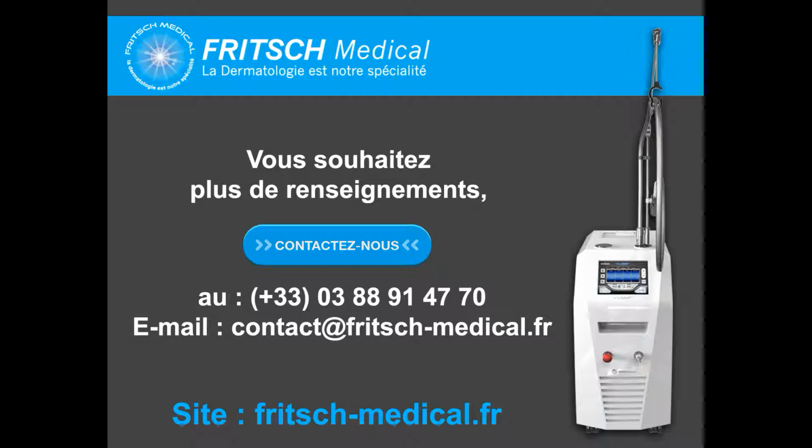It is enough, not necessary to put 5. For vascular 5, for pigmentation 10 degrees, but it's depending how long you stay with your spot, you know. If you stay a lot, you reduce the temperature of the skin. So it's very important for skin pigmentation. It's necessary to destroy the skin pigmentation.